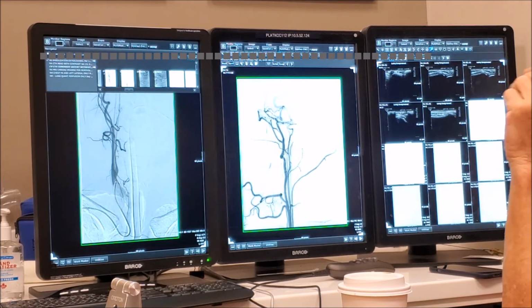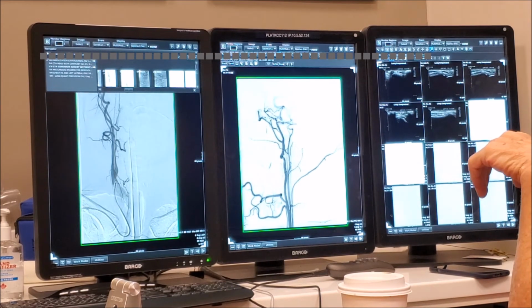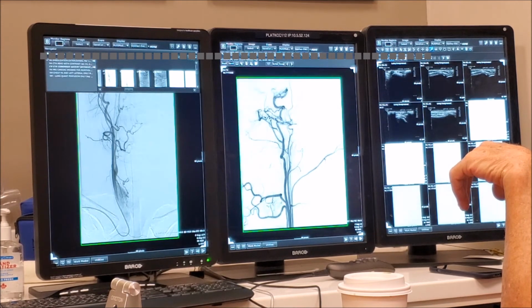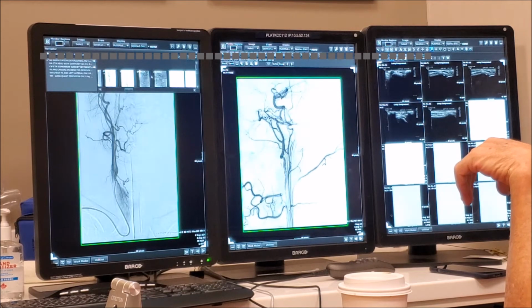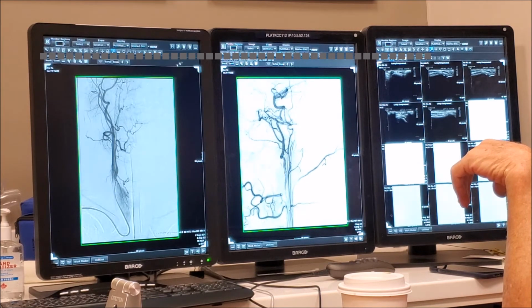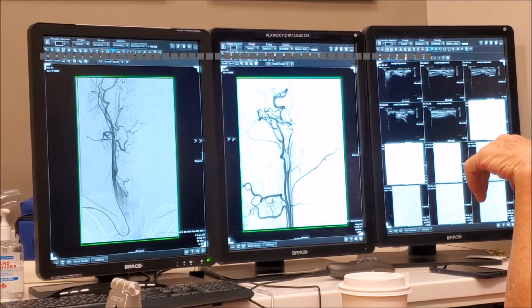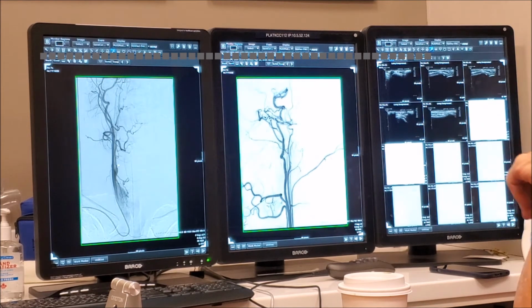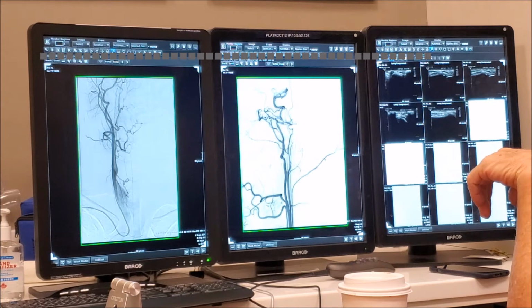Sorry, it's someone texting. Okay, and then we have this, which is the concavity. This would be possibly part of the middle meningeal and coming in towards the orbit. So it's a meningolacrimal. Look at that. Do we have a picture of the head here? Next time you have something like that, take a picture down here and all that. I would have put the catheter right here and done a gentle injection because it will show you amazing stuff.